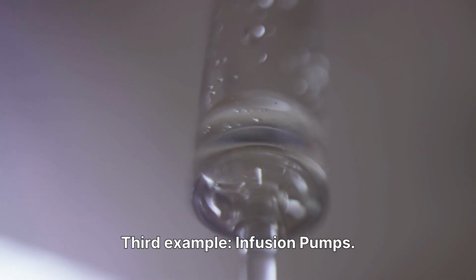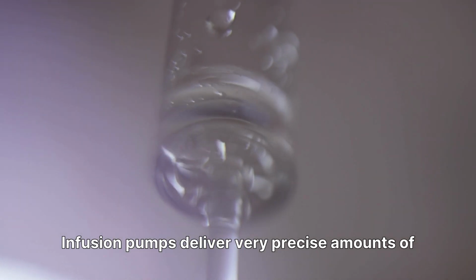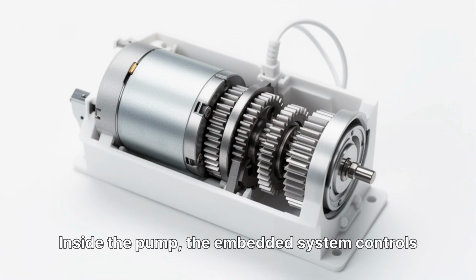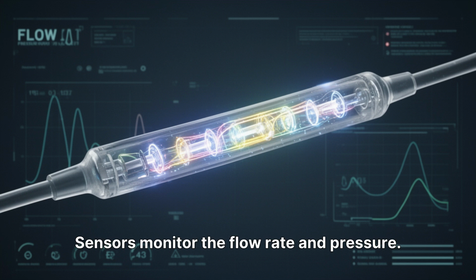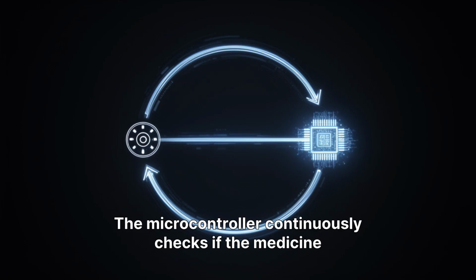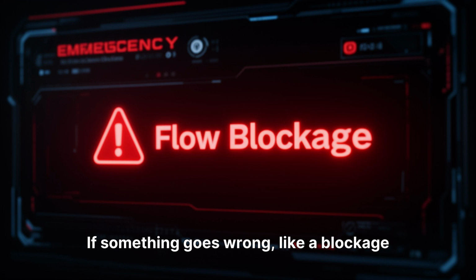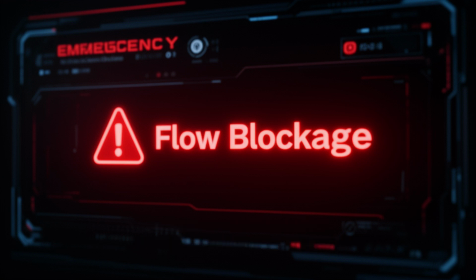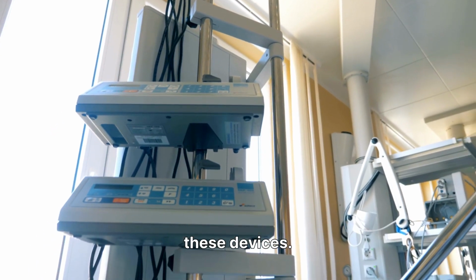Third example, infusion pumps. Infusion pumps deliver very precise amounts of medication into a patient's body. Inside the pump, the embedded system controls a motor mechanism. Sensors monitor the flow rate and pressure. The microcontroller continuously checks if the medicine is being delivered at the correct rate. If something goes wrong, like a blockage or incorrect dosage, the system immediately triggers an alarm. Safety and reliability are extremely critical in these devices.